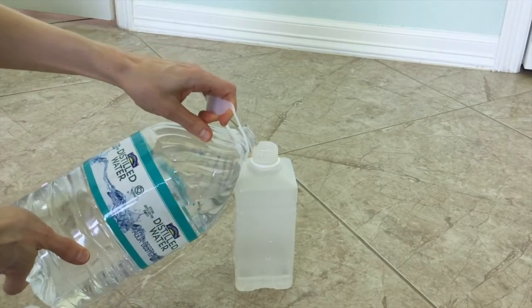Before lying down for the afternoon, I check the water level in my water chamber. I have a 1 liter bottle which is connected to my water chamber. The 1 liter bottle has distilled water in it, which lasts about 24 hours. When the water in the bottle runs low, I will open up the bottle and add more distilled water.